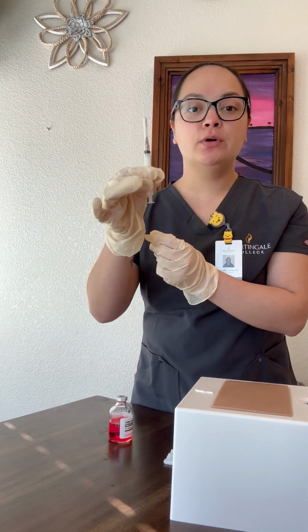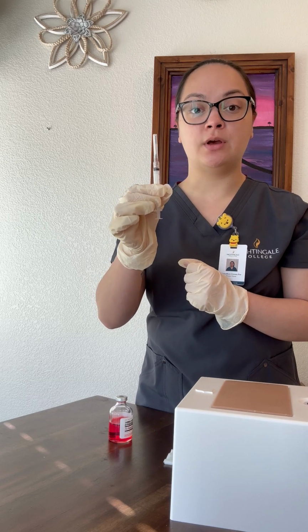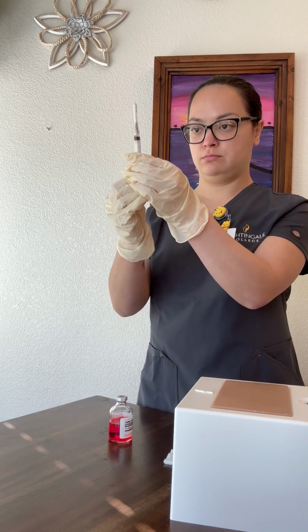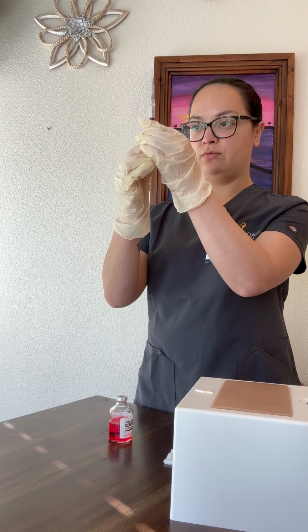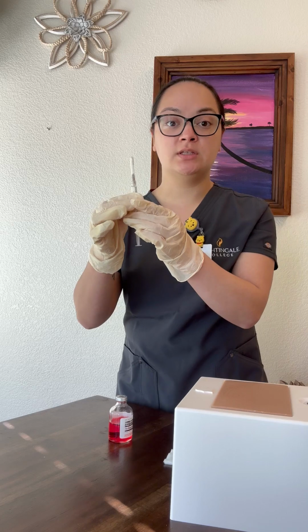Okay, so we will be drawing up 1.5 milliliters of air. Okay, now we'll inject this into our vial.